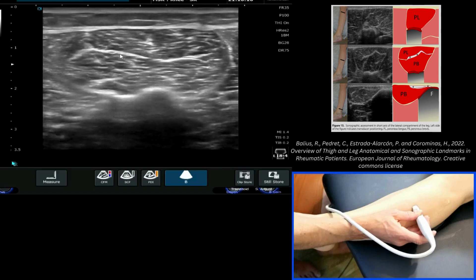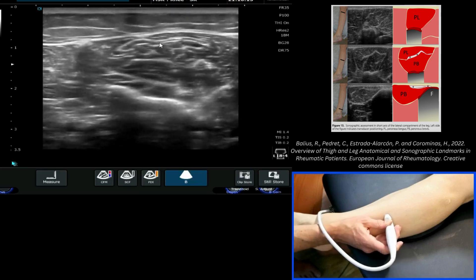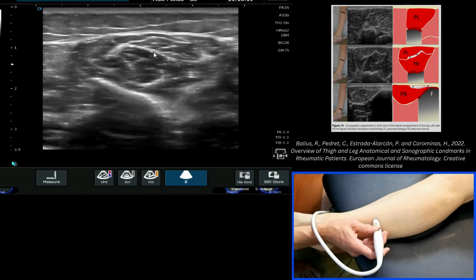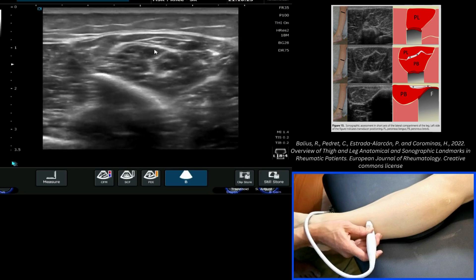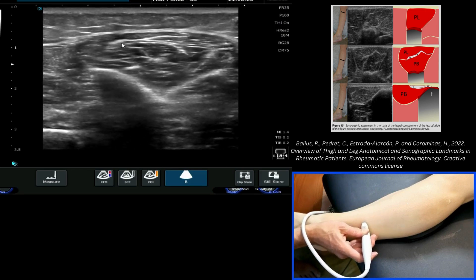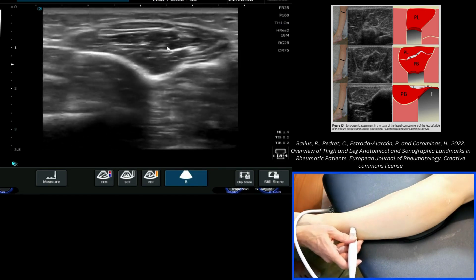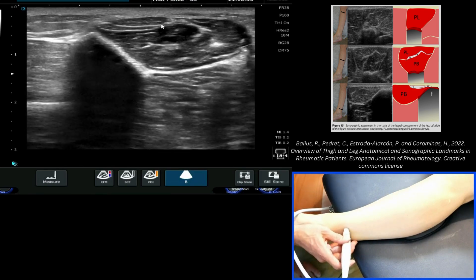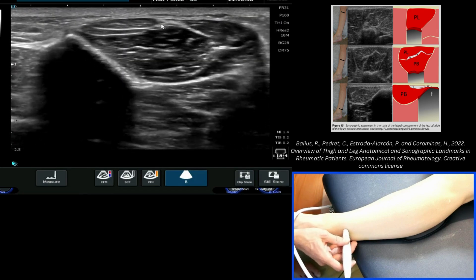If we then start to roll back down, we see the formation of the longus tendon sitting most superficially. As we come to that lateral lower third of the fibula, we see the formation of the peroneus brevis tendon. That muscle is still very much feeding into the tendon. At this point I want to reduce my depth to give myself the best opportunity to see this really clearly.